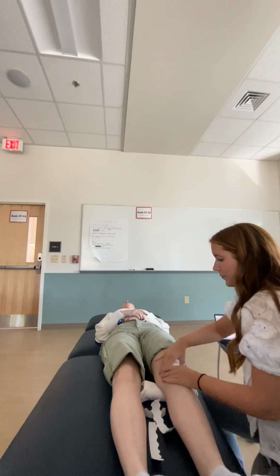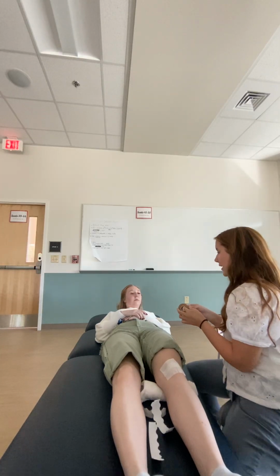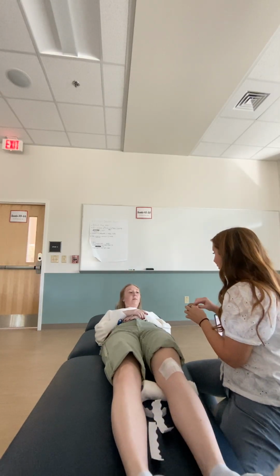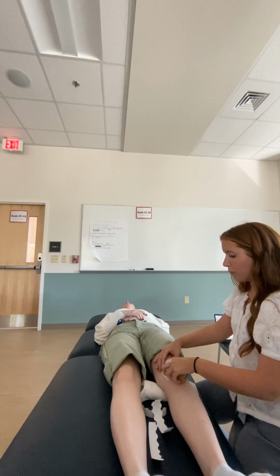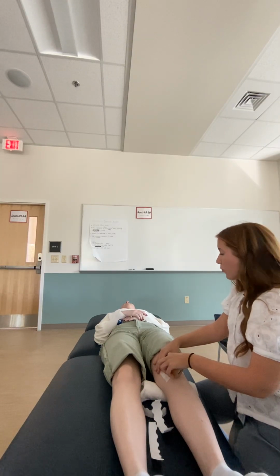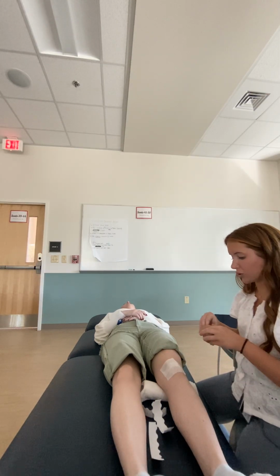Does that feel okay? Yeah. Okay, next we're gonna use this rigid tape. It kind of feels like duct tape, which might feel weird. But what we're gonna do is basically have the tape pull your knee a little more medially, to try to prevent that lateral tracking when you're doing your squats, which is causing you pain, okay?